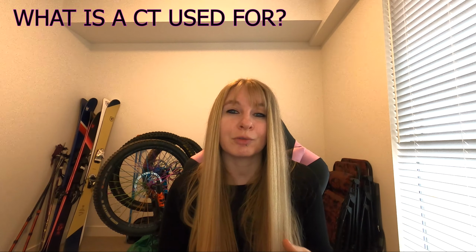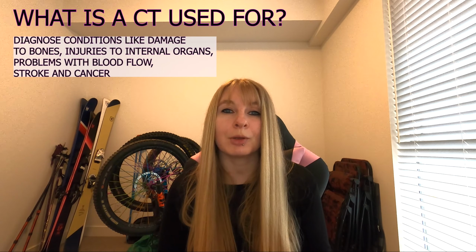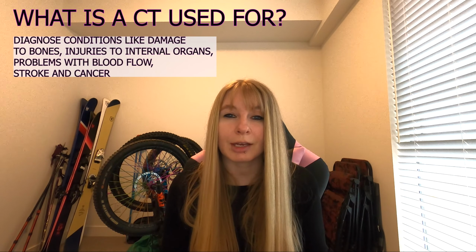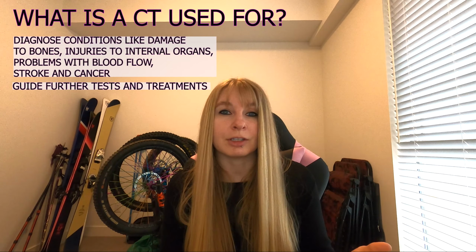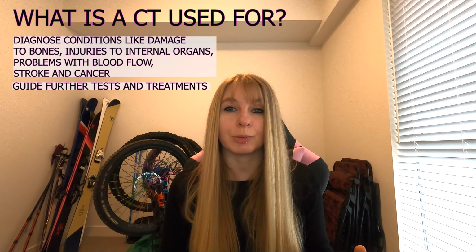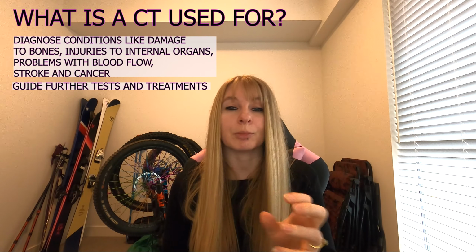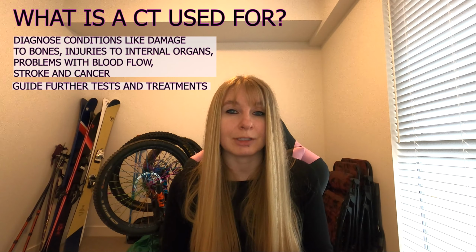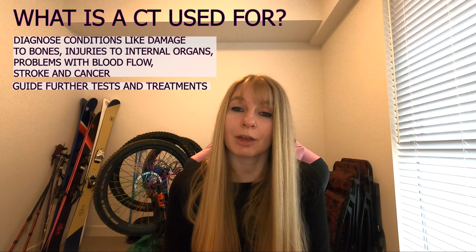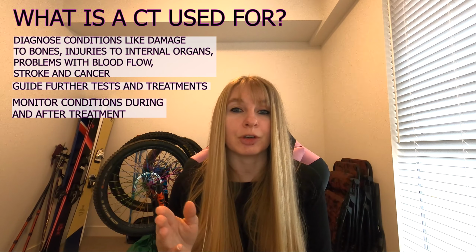So a general overview of what a CT would be used for would be to diagnose conditions like damage to bones, injuries to internal organs, problems with blood flow, stroke, or cancer. It's also used to guide further tests and treatments. So for an example, if a surgeon was going to be removing a tumour, they might order a CT scan before the operation so that they could see the tumour from all different angles and know what they were going to be operating with. Or a CT might be ordered to see a tumour before having other treatments like radiotherapy. It's also used to monitor conditions like before, during and after treatment.